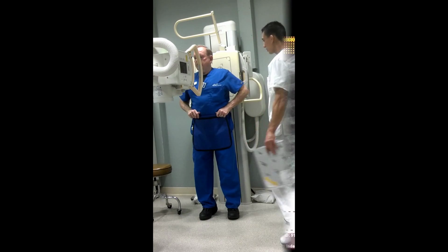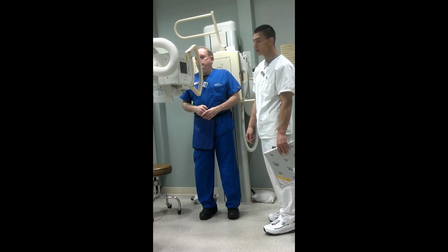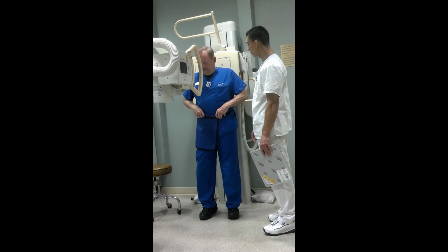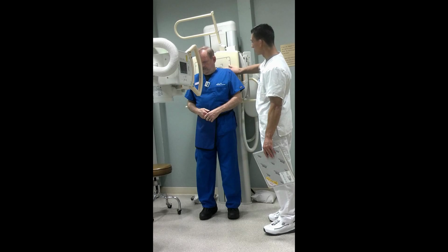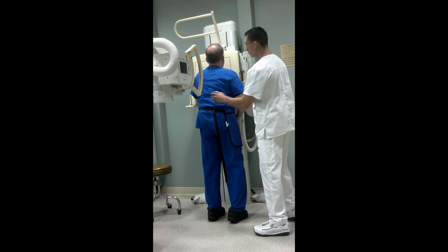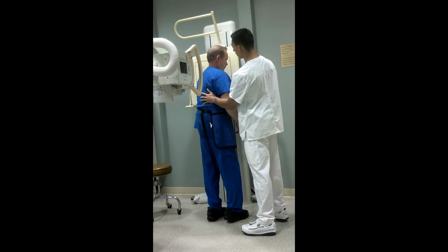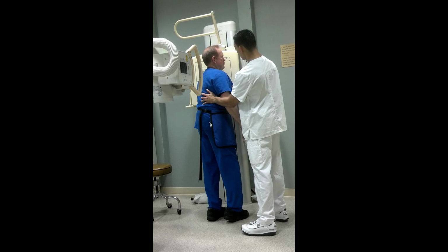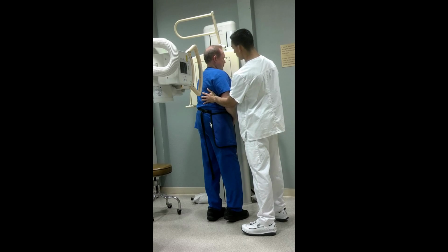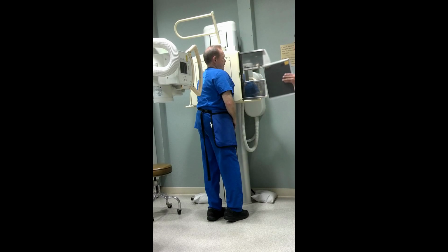Okay guys, so our last shot here is the shoulder Y view, and I'm just going to have him turn around and face the bucky here. We'll have you face the bucky, and I'm going to rotate him about 45 to 60 degrees to the LAO side there, and that looks about 45 or so there. Make sure that we get our IP. I'm going to put it in portrait wide this time for this one. Make sure we get all the scapula.